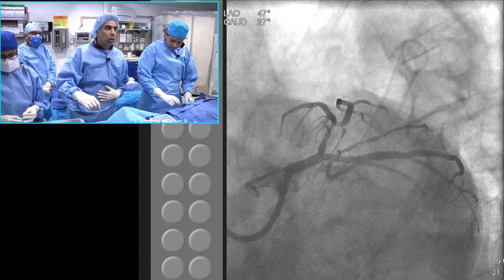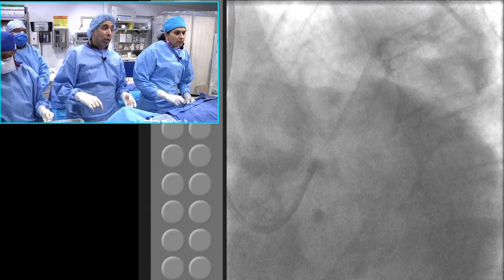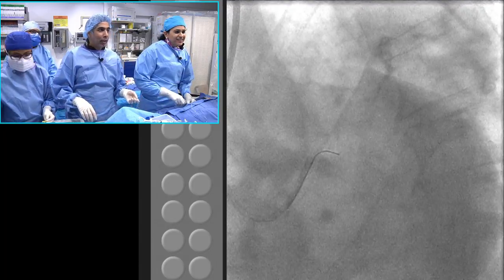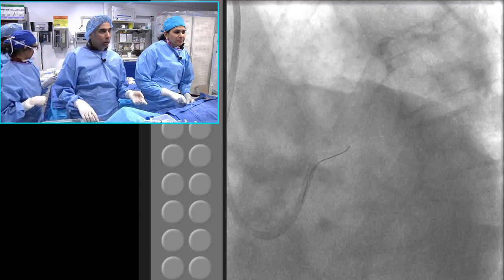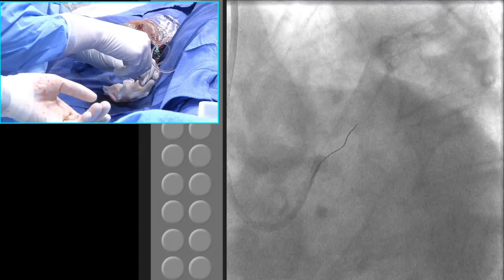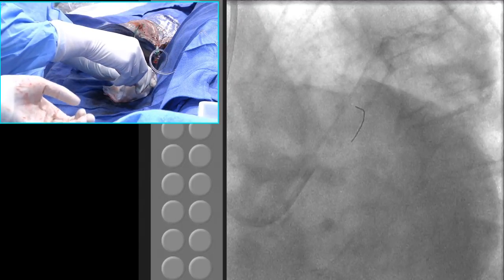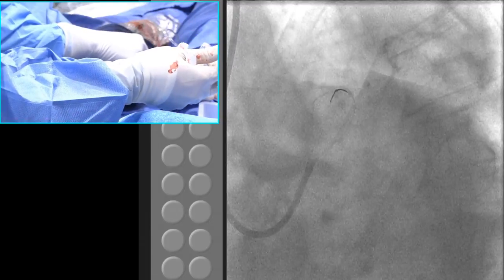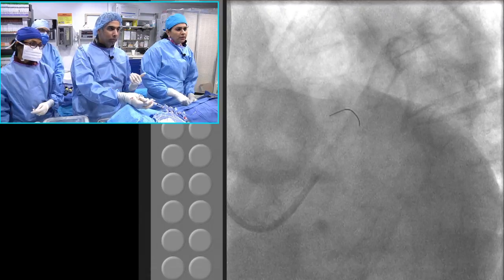Nathan, which case will you not do a transradial? I'll consider it if the patient does not have a radial in both arms, and that's the ulnar, that's pretty much it. Certainly bilateral IMA cases, post bypass with a pedicled LIMA and RIMA, but even those we'll still try. Sometimes cases which definitely need a left ventricular assist device or something, even those you can do radial PCI.